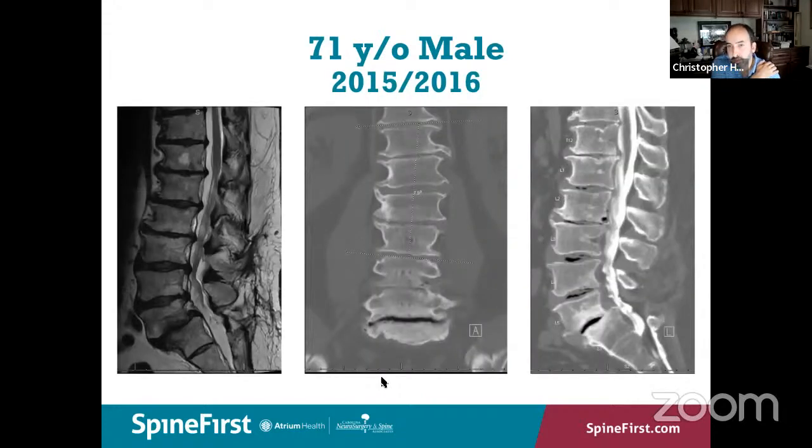He had subsequent imaging in 2015 and 2016. With the MRI at left, you can see now progression to a Meyerding grade 1, almost grade 2 spondylolisthesis at L5-S1, severe multi-level degenerative stenosis, and progressive degeneration of the intervertebral discs. He's developing some asymmetric disc collapse with a mild coronal deformity, obviously here measured on CT and more appropriately measured on weight-bearing upright films. But we see here gas within the disc spaces almost diffusely and severe multi-level degenerative disease.